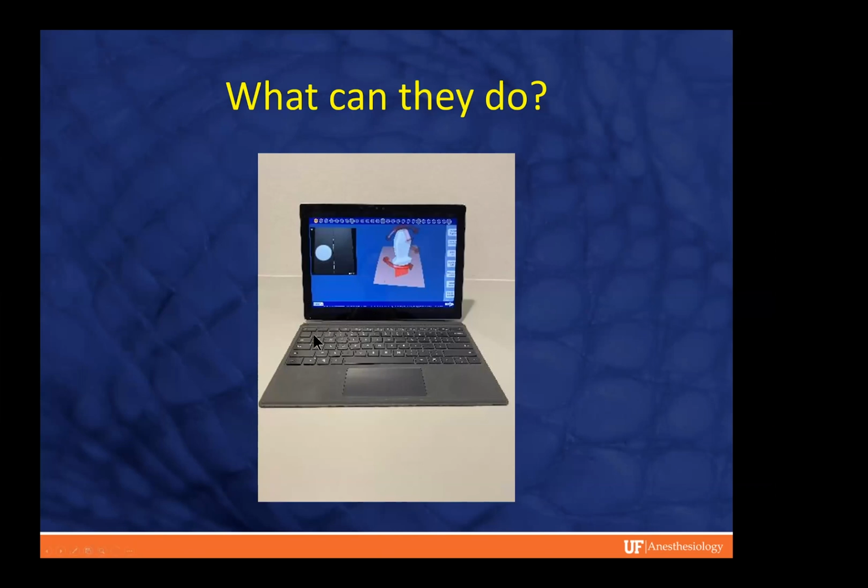This doesn't really have an image of the cognitive aid on it, but it is capable of telling you, if you put an ultrasound probe on the surface and you want it ultimately perpendicular to all planes, whether your ultrasound is twisted or tilted, and which direction you need to move it to correct that.